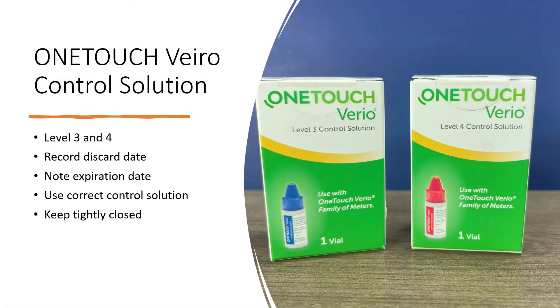Control Solution available for the OneTouch Vario meters are Level 3 and Level 4 — those are the two levels available. The manufacturer says one or the other is fine; you don't need both. You do want to record the discard date. The vials I have had a six-month discard date, so once you open them, you need to discard them in six months or by the expiration date, whichever is sooner. Always be certain that you're using the Control Solution designed for your specific meter, and when you're not using it, keep the lid tightly closed.